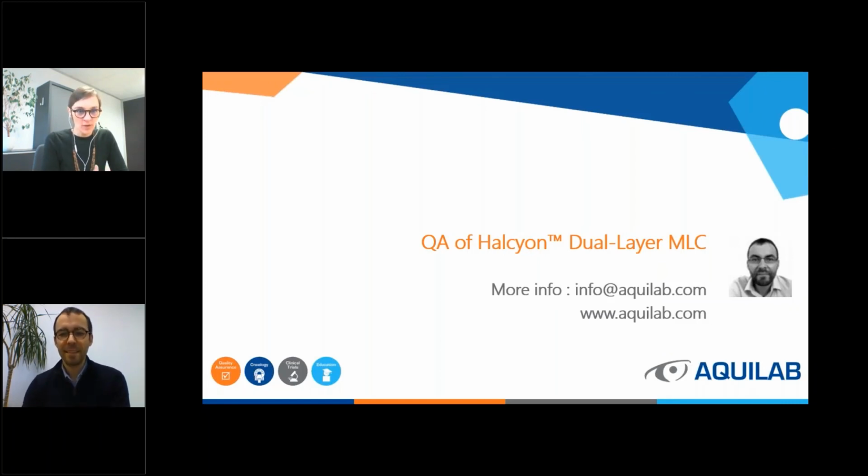Okay, thank you. One other question from an attendee is, what are the MLC tests for Elekta Linac Versa HD? In fact, we have a dedicated module called MLC. In this module, we have specific tests for the static part and dynamic part. But maybe if this person wants a demo, it will be simpler to show the parameters. But yes, these are some mechanical parameters. We will contact you and give you more information if needed. That will require a more in-depth presentation.